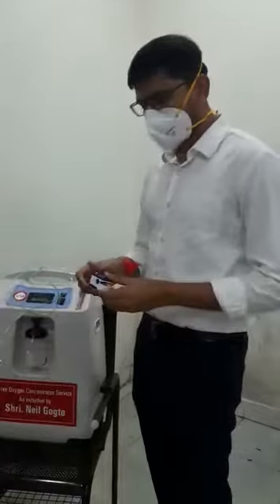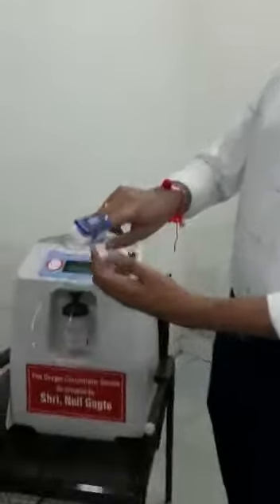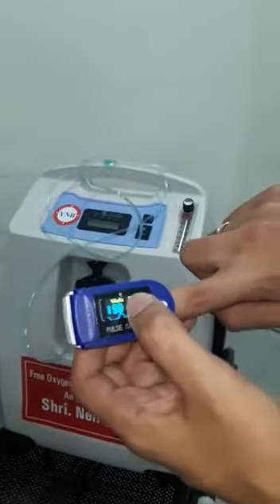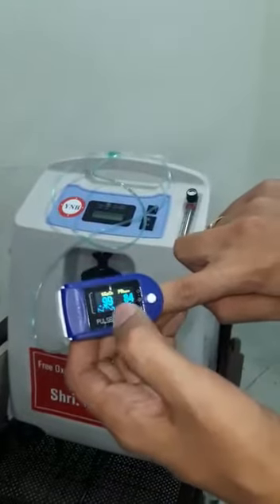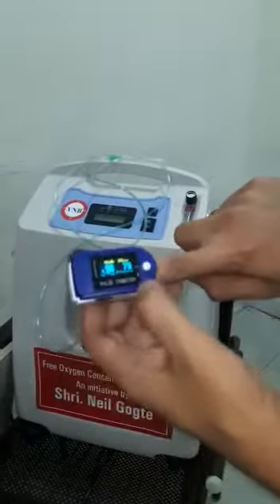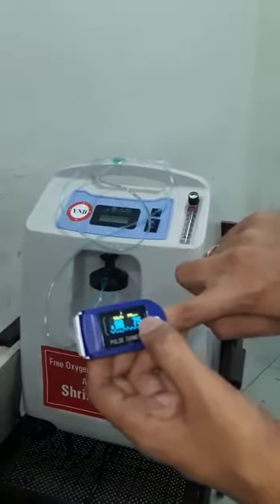Before using it, check the saturation of the patient using a pulse oximeter. Put it on the finger like this — it will show two values: SPO2, that is oxygen levels, and pulse rate. Oxygen levels should be more than at least 85 to use this machine at home, and pulse rate should be at least less than 110 to use this.